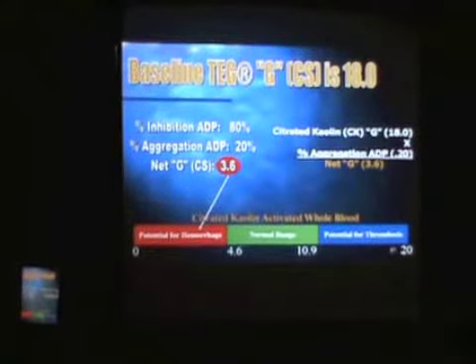Where we'd like to put them post-stent is the lower side of normal. Remember, in Gurbel's and McCrath's study, 9.3 or greater is the third quartile, and they're still at risk. So anything less than 9.3 and greater than 5, 5 to 9.3, is where we like to keep them, in a safe spot.